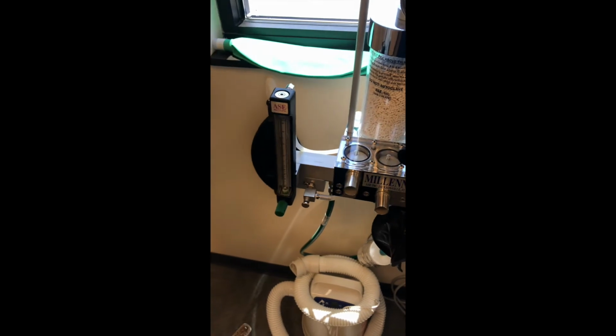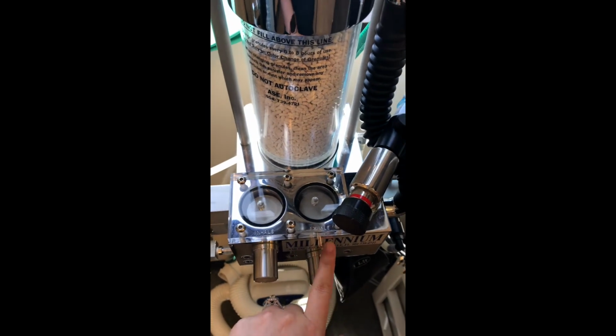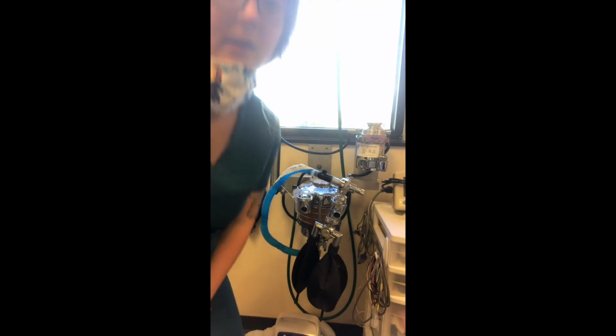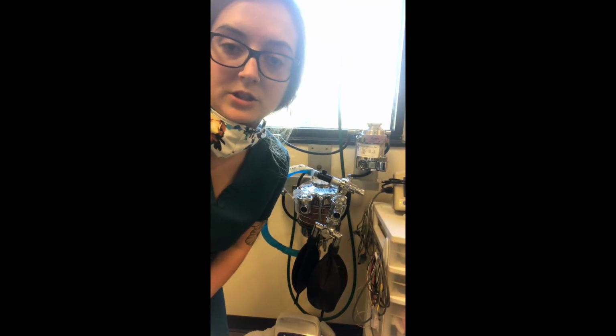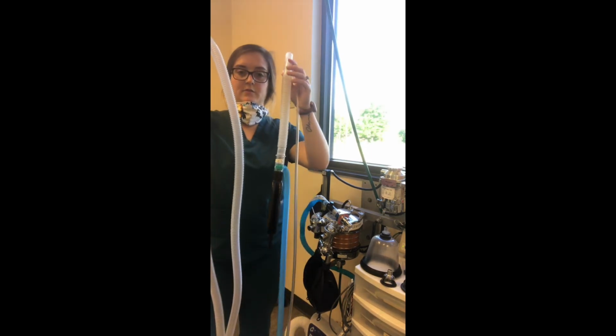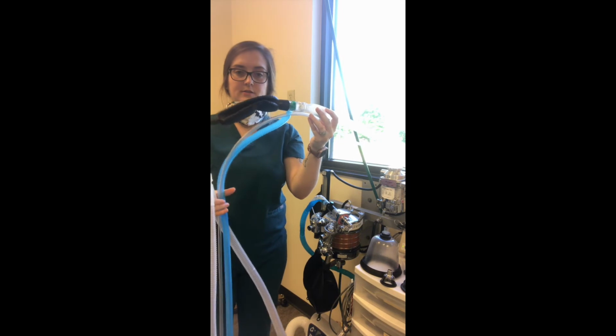On the anesthesia machine, we also have our inhale and exhale ports. You would have your tubes connected there, and that is what is in our anesthesia machines. So the two different types of tubing here: the first is our non-rebreathing system.